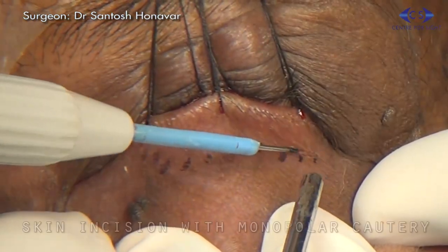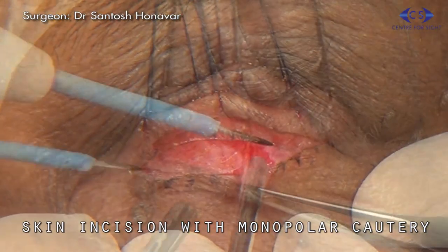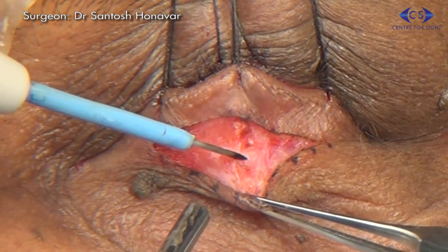Using a radio frequency probe, the incision is made along the marking and dissection of the orbicularis is carried out at a 45-degree angle.